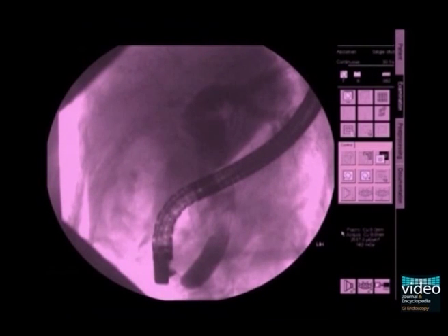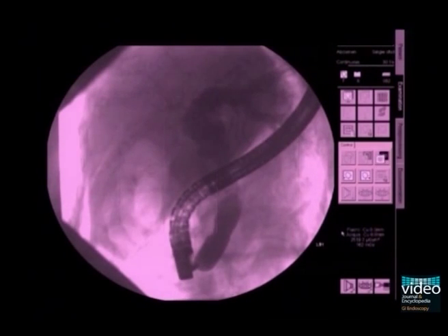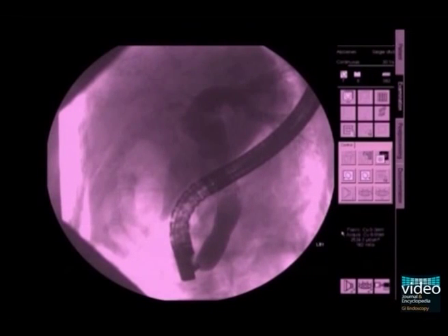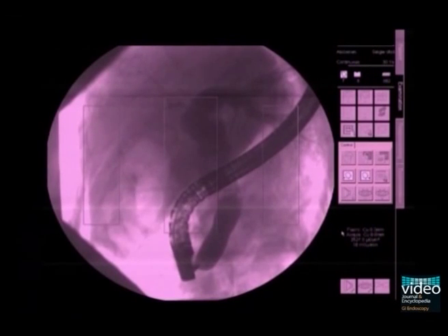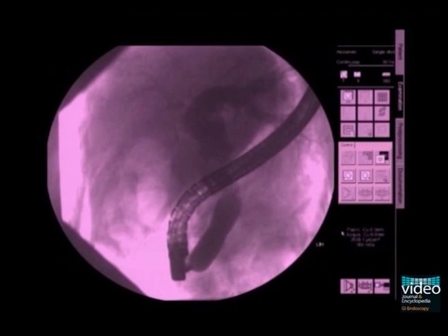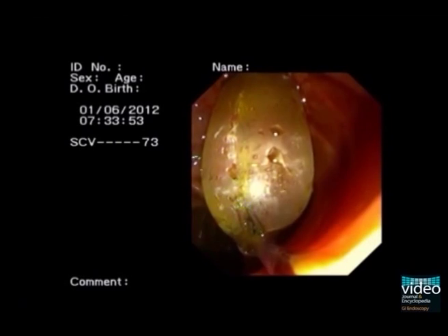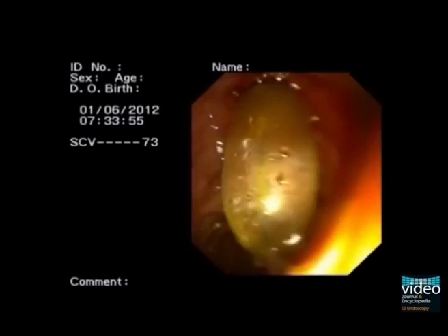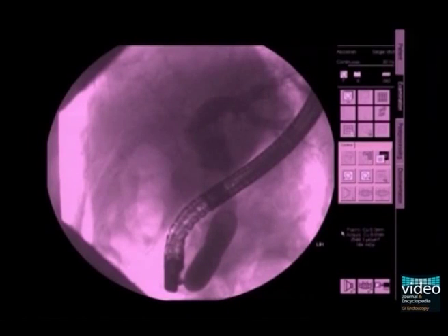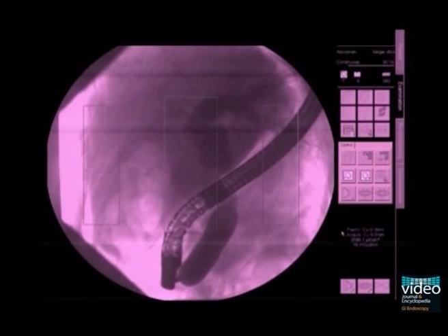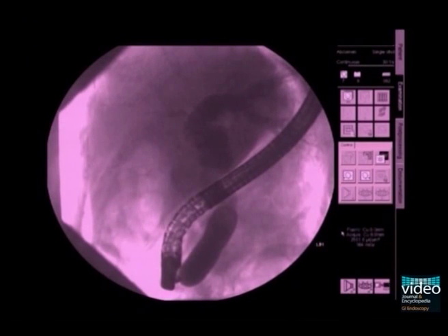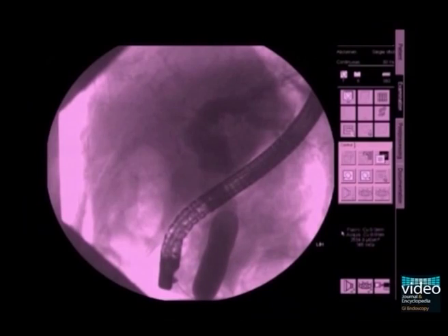Dilation with the balloon fully inserted and at maximum pressure. Dilation with cylinder and waist disappearance, confirming complete dilation.